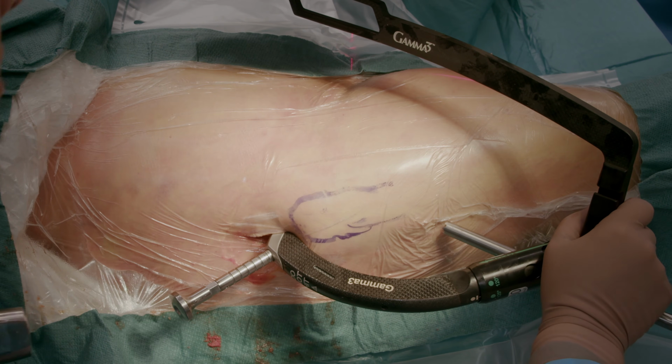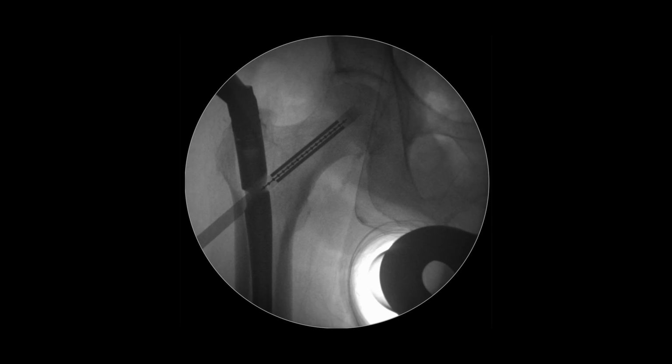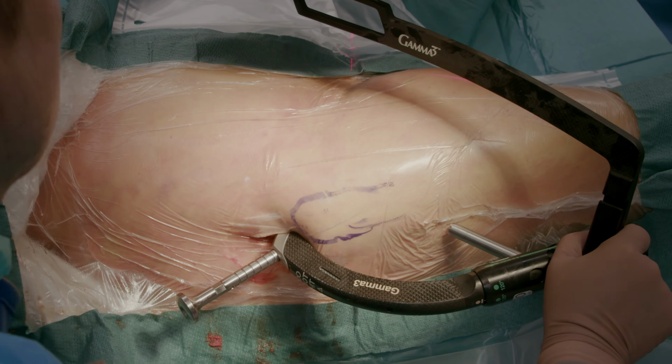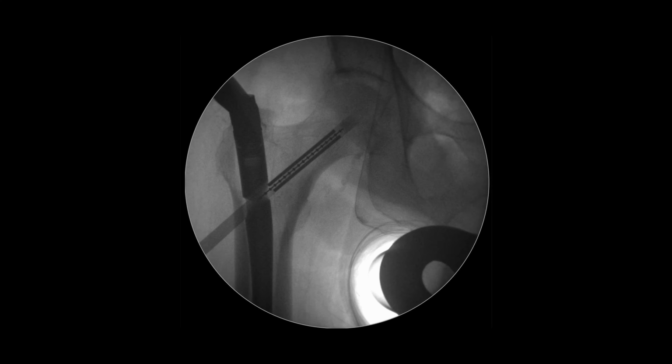We impact it still a little bit more distally. Now it looks very good. As you can see, the string of beads is just between the two solid lines.